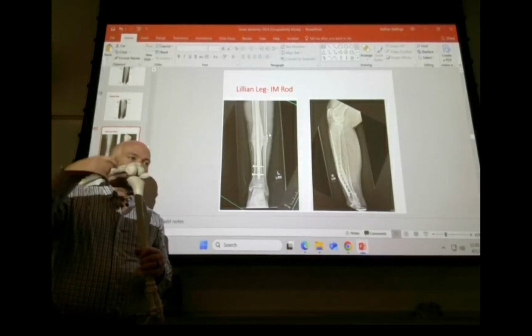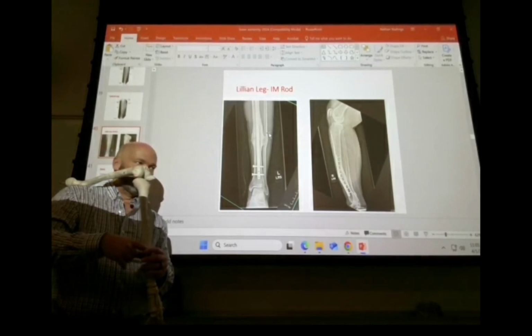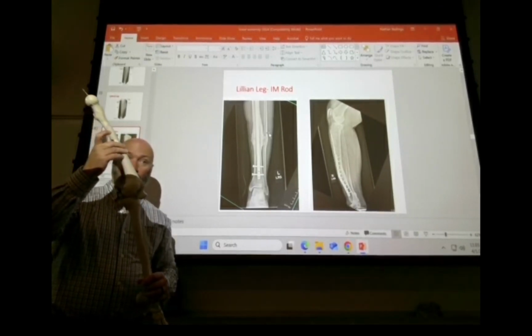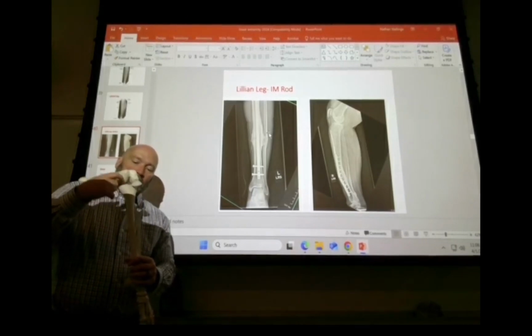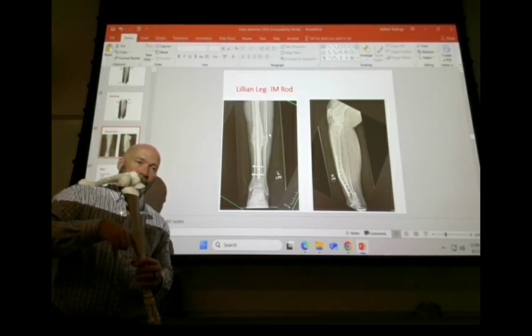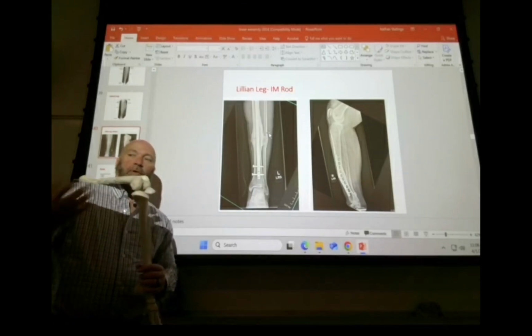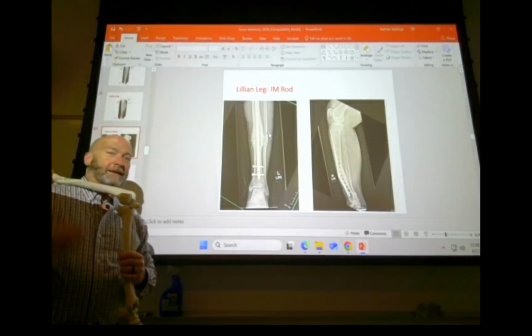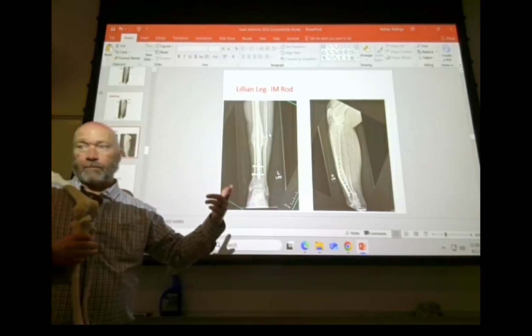And what they'll do is they'll take like an auger on a flexible screw bit type thing. The first thing they'll do is run a guide rod all the way from one end of the anatomy to the opposite end. Where you see IM rods, that's intramedullary rod, it most commonly would be in the femur, secondarily in the tib fib, probably third would be the humerus. So they put this guide rod down in it, and then they run that auger bit to just clean out the medullary cavity. The purpose for the guide rod is to make sure that you're going into the bony fragments, right? Once they get it all done, they hammer this thing in with this great big slap hammer, and it sounds like body shop, you know, bang, bang, bang. They drive it all the way down to the bottom, and then your part becomes more difficult.